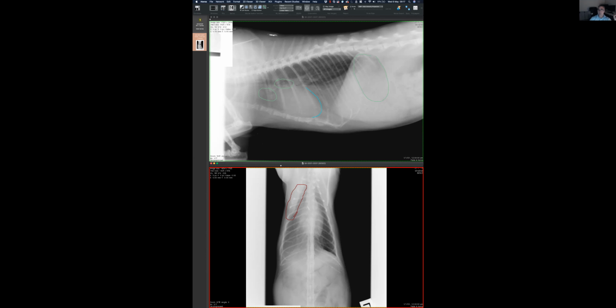What I will do is clear up the ones that I think probably should not distract us moving forward. And then I'm going to start asking to go deeper in the features that I think are relevant. So to clear up, I'm going to put together the description of the poor serosal detail with the body condition, which is not that much falciform fat. I'm going to put that together with the exposure. I think the exposure and the technique and being a little bit thin explain the detail in the abdomen. So my conclusion will be that based on those contours, the serosal detail is not great, but it's a bit thin. So I will leave that as at least questionable. I'm not sure there is fluid there. I will leave that on the side.